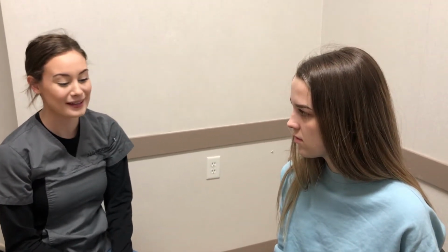We'll start by taking your blood pressure. First, we're going to begin by wrapping the blood pressure cuff around your upper arm. Then I'm going to start by pumping the blood pressure cuff, so you may feel it start to get tighter as I continue to pump. The reason we suggest taking blood pressure is to ensure there are no health risks, so we can proceed with the rest of the appointment. Okay.